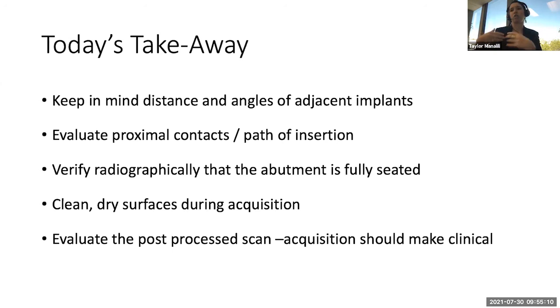Hang in there. These chairside systems that we use now are going to get there. It's getting better and better every year. I don't think there is a need to go out and buy a whole new system at this point. But just keep in mind the distance and angles of your adjacent implants. Take 2 minutes to evaluate those proximal contacts, your path of insertion. Always verify whatever abutment you are using, whether it is a conventional or a scan body, that it is fully seated before you take that impression. Make sure you clean and dry all of your surfaces really well for the most optimal acquisition.